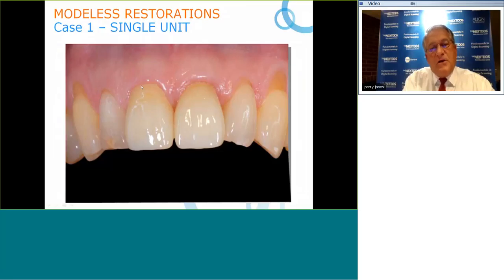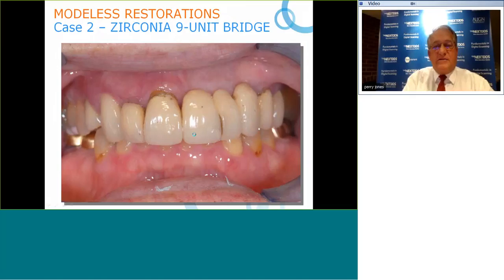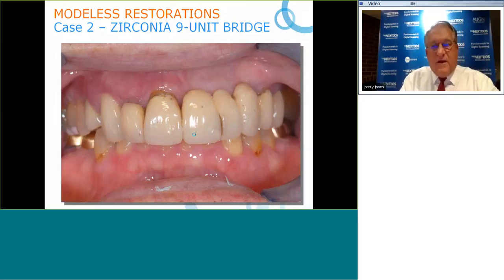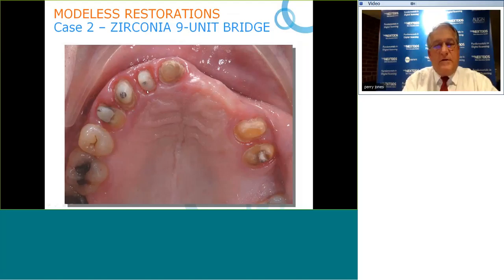These zirconia crowns can blend colors — for example, a B2 blended with a B3 to create a nice gingival margin that looks very aesthetic. Not custom-stained, but the color blend is effective. Here's a long-span zirconia nine-unit bridge. A failed restoration over time — lateral incisor number seven has decayed — will be salvaged with an intentional root canal, post and core, with conservative preparations.